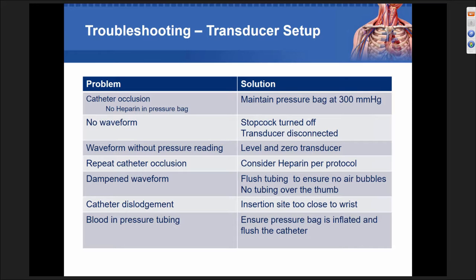In practice, if you think about when you send a patient to the OR, what do we do? We take their jewelry off and we give it to their family. And we do that because we know that we are going to give them fluid, they're going to have fluid shifts, and they're going to swell. So why, if you're one of these people or one of these facilities that put it around their thumb, would we do that in practice? Patients can manipulate their wrist.